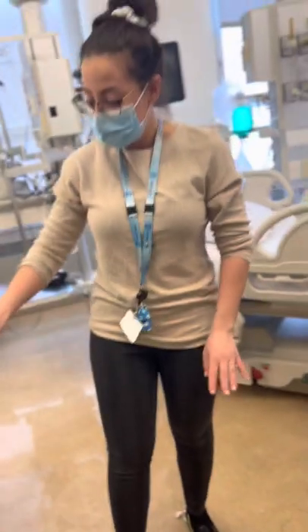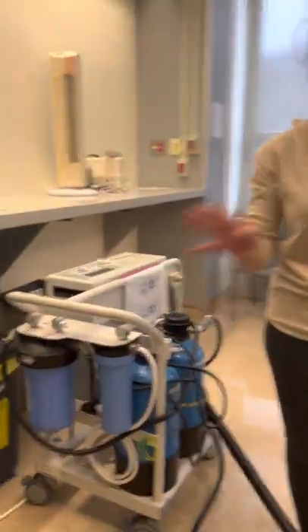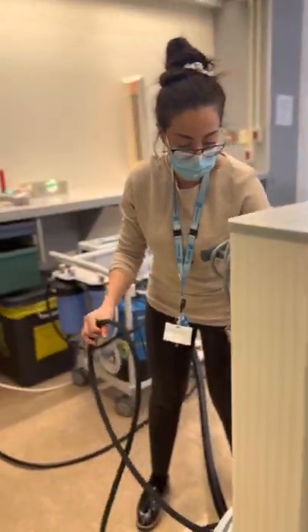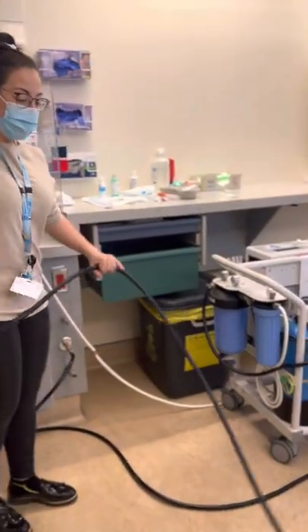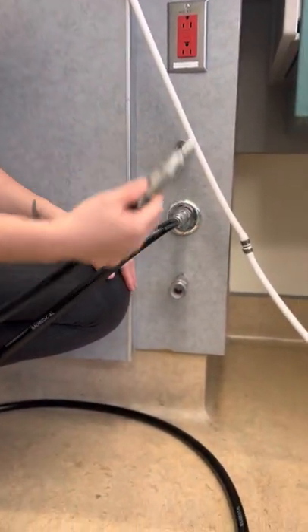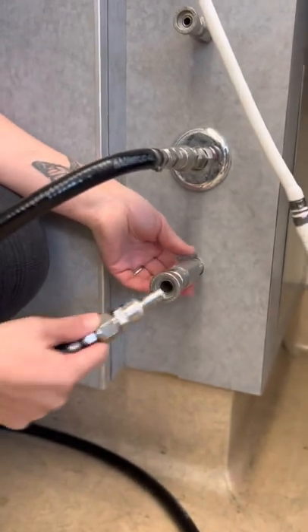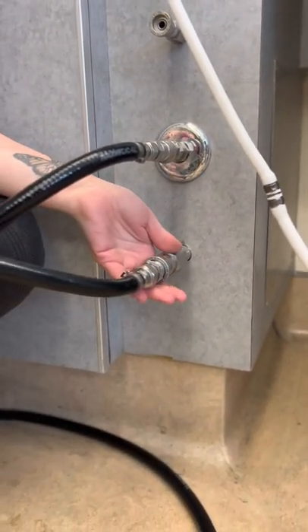Now we have all of the water components connected on the Aqua Uno. Now we're going to move on to the dialysis machine. We have to connect our drain. The drain aspect is here — it is a quick connect, but if you were to try any other segment, it would not function. You're going to hear a click, pull back, and now we are secure.